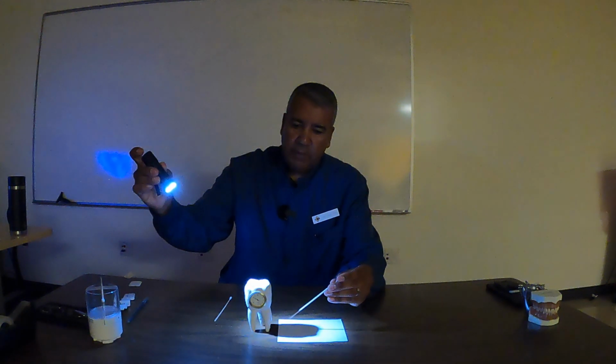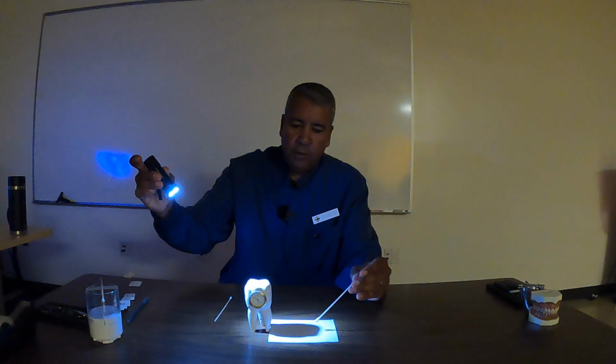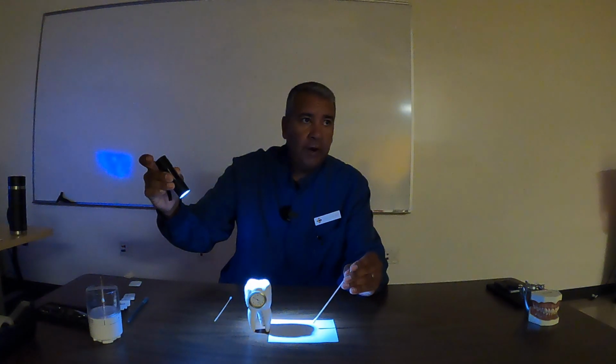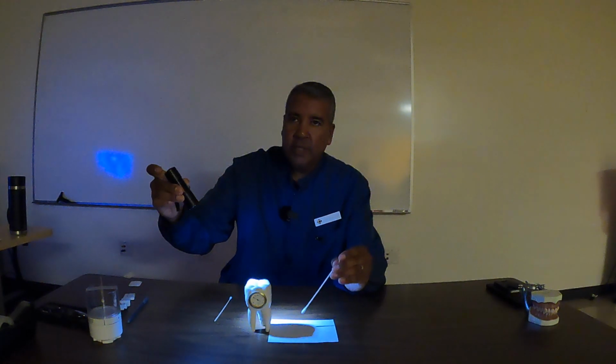the flat portion of this parallel to the bisector. I'm going to bring it back here, and I'm going to take the x-ray. And if you take a look at that, you can see that the tooth is pretty much the same. If this was to fall, it would fall right there. If that tooth was to fall and lean this way, it would fall right there. So it is basically the same length as that tooth represented on that film.